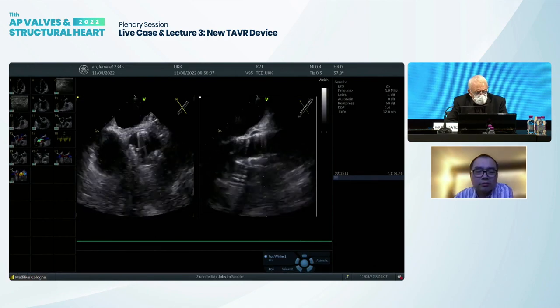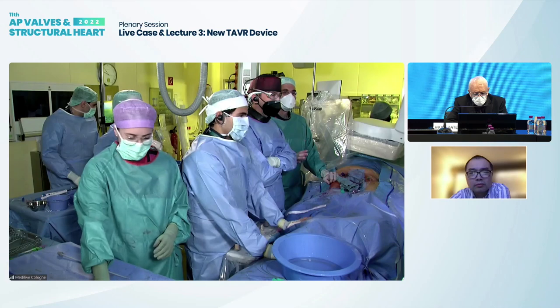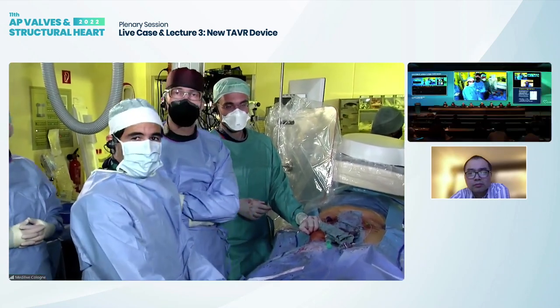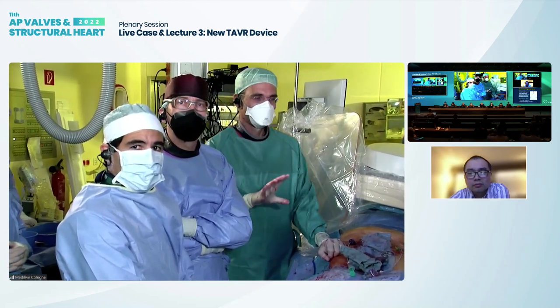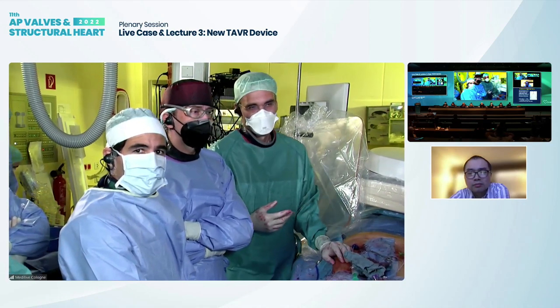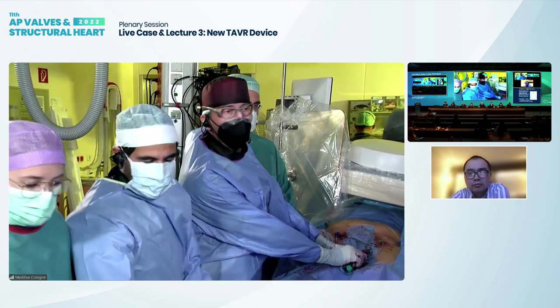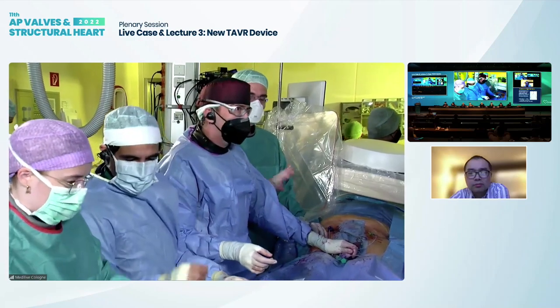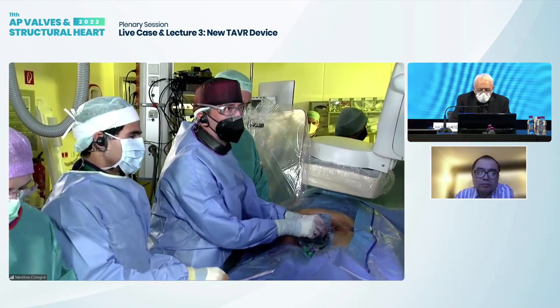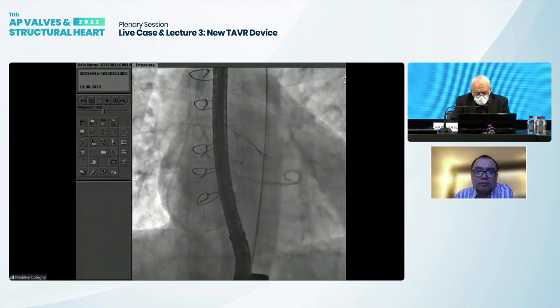So, Matti or Stefan, could you briefly talk to Professor Kim about the stenosis part? Well, there have been trials, and trials are ongoing on both etiologies, on pure aortic regurgitation as well as on patients with aortic stenosis. The fact that you are able to position this valve in an anatomically correct way, with no stress on the annulus, but rather fixating the valve by clipping, may reduce pacemaker need in patients with aortic stenosis, and may make this valve a very attractive choice, in our view. Not the heavily calcified, right? Yes, exactly. But would you do an angiogram too? We will prepare this right now.